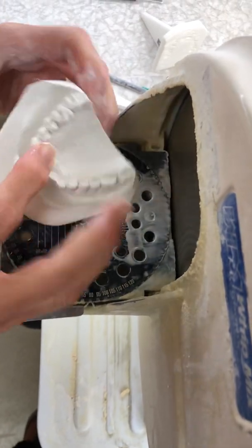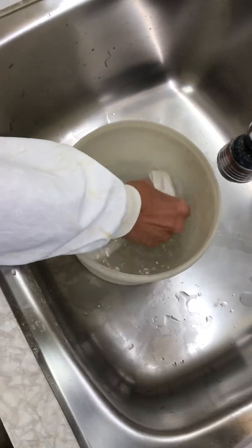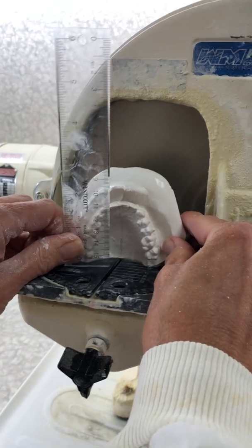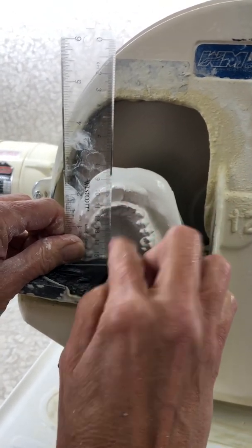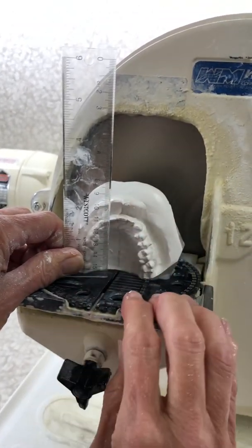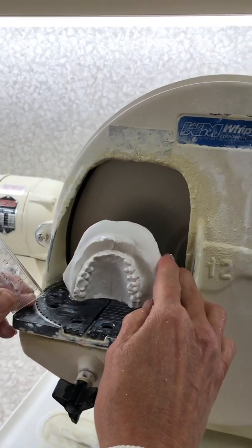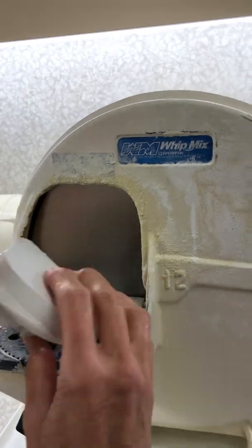Okay, that's pretty close. I'm just going to run it under the water again, just so it's nice and easier to look at. All right, so you see what I'm talking about, where that line is level with that line. That's basically what we want, that those lines are parallel. All right, so that's good. We've got that. Let's throw that in here.